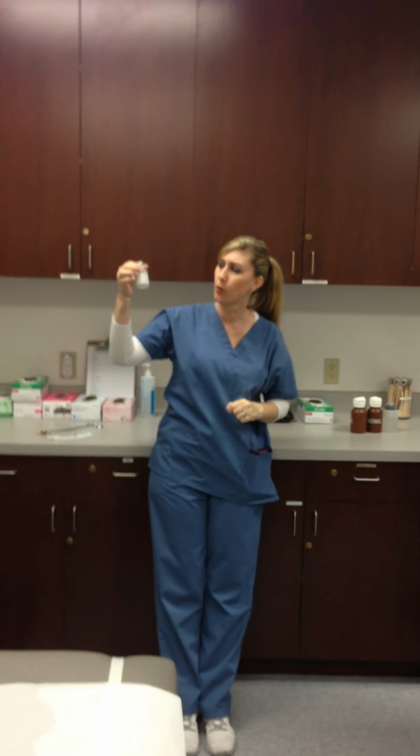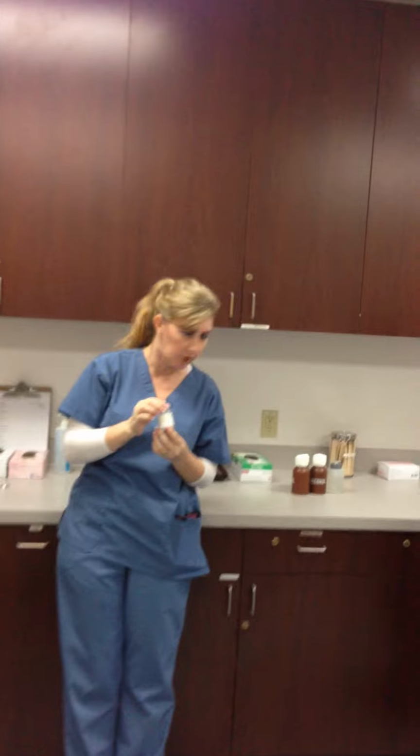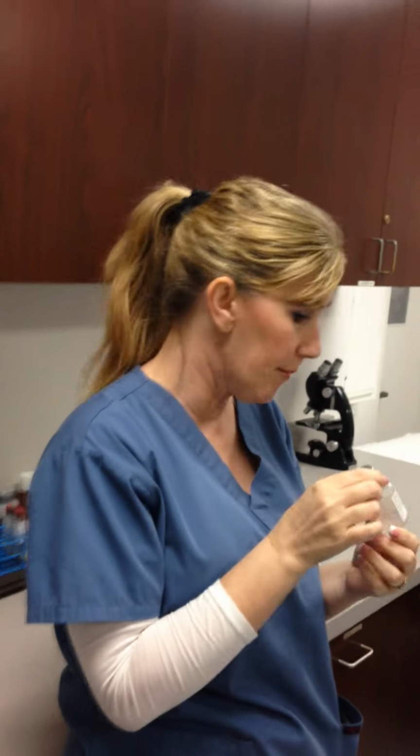Okay, so here we have our medication vials, right? Of course, this is just water, as you guys know. So on your medication, what you're going to be looking for is the name of the medication that you're giving, because your doctor has ordered it, okay? Doctor orders 250 milligrams of amoxicillin, okay? So you're going to go ahead and pull out your amoxicillin or whatever it is that your doctor has ordered, right?